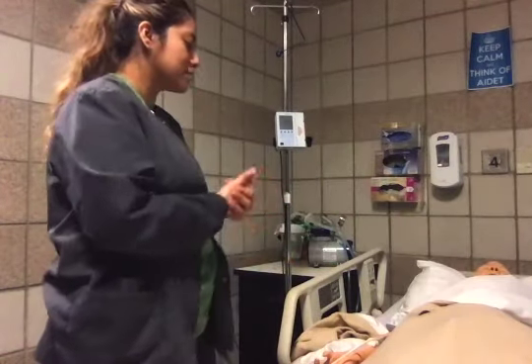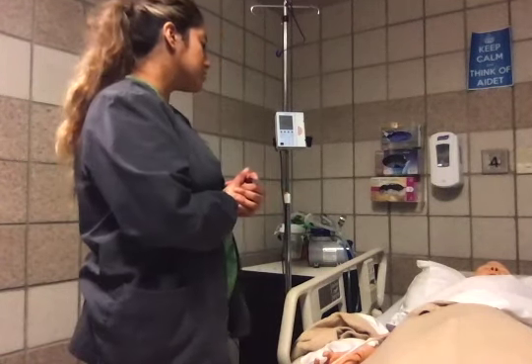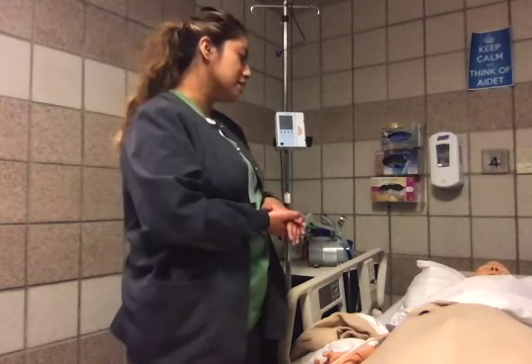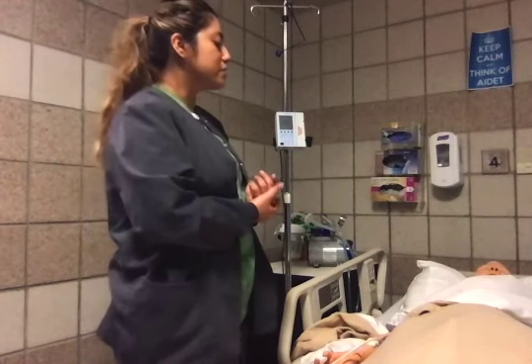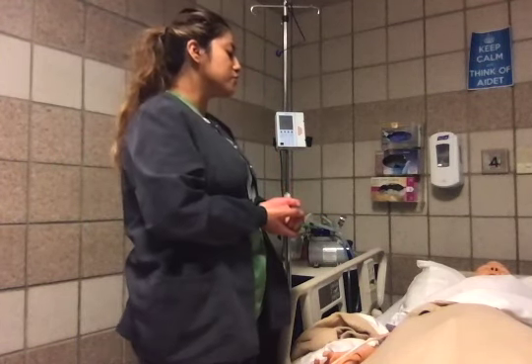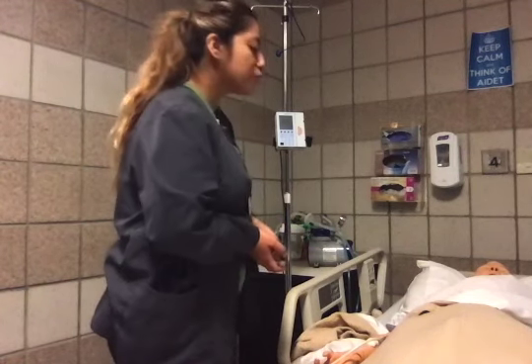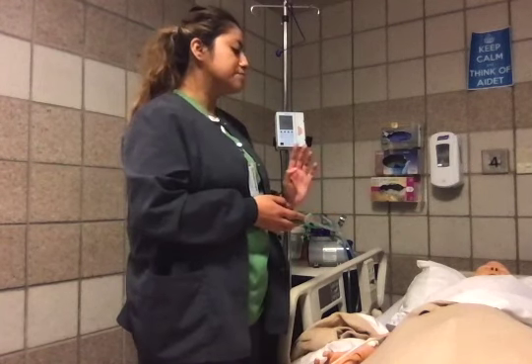Hello, Mr. Ivy. My name is Hefzi. I'll be your student nurse today. We are going to be administering your antibiotic through your IV, and this will take 10 to 15 minutes. The medication that I will be administering is for your pneumonia. The name of it is piperacillin, and it's going to be 4.5 grams every 6 hours.